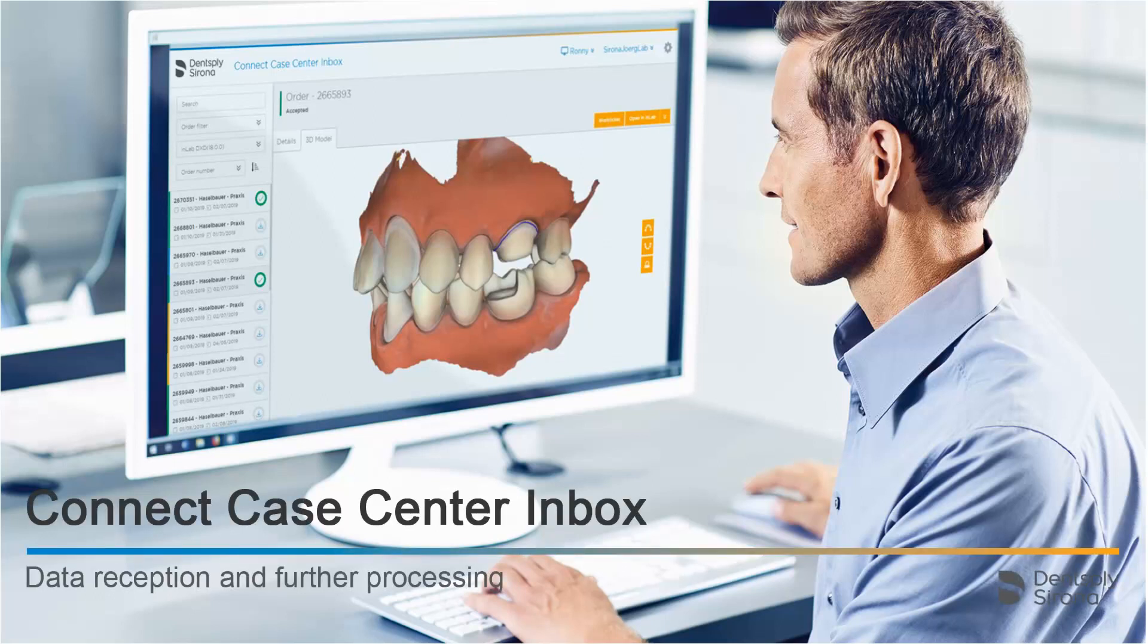Welcome to this video tutorial on the topic of Connect Case Center Inbox. In this tutorial, we demonstrate the reception of data and further processing.